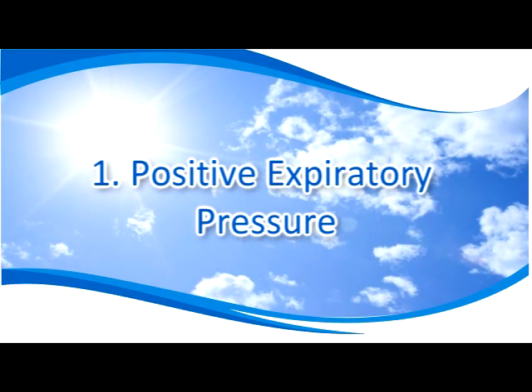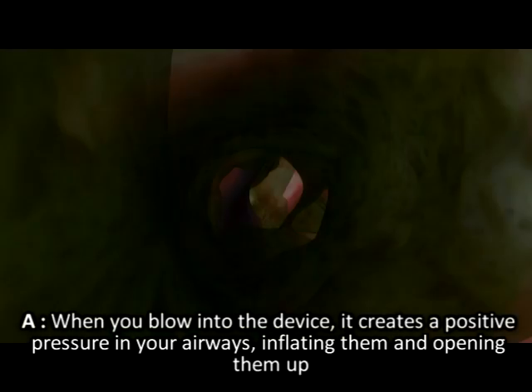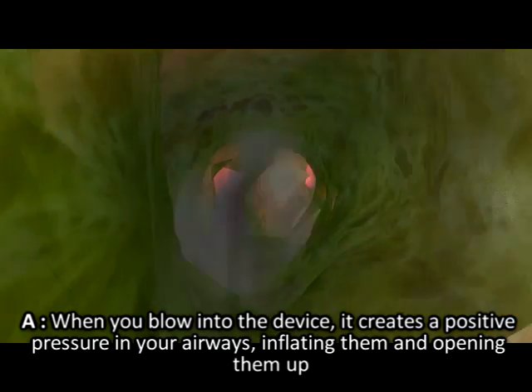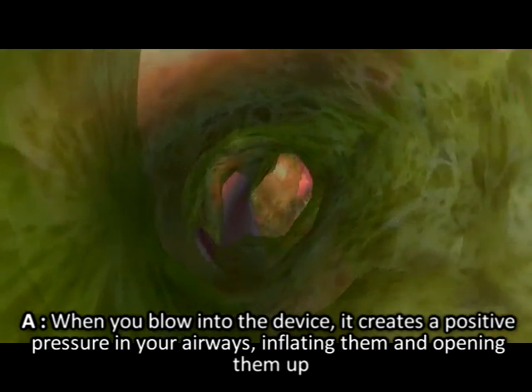Positive expiratory pressure: when you blow into the device, it creates a positive pressure in your airways, inflating them and opening them up.